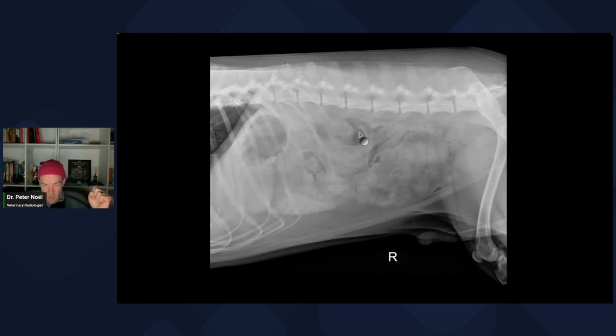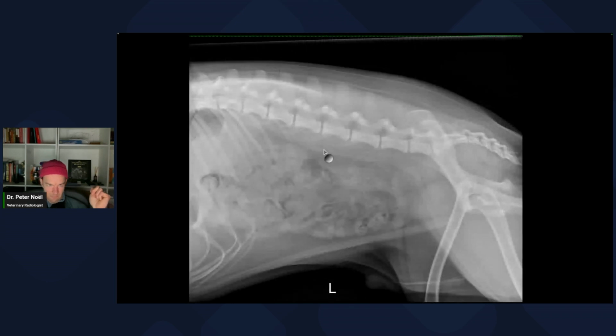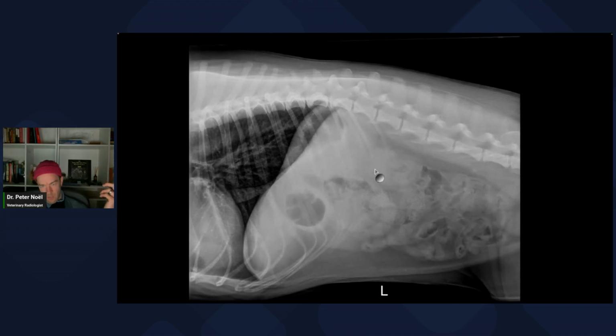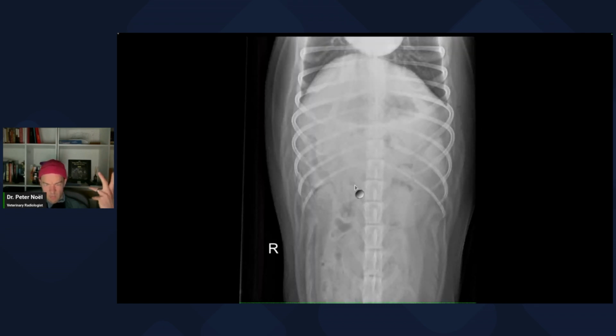They're up here somewhere. They should be up here. Hard to see. There's probably one. Caudal border of the left. Hard to see. Not going to make it. Oh, here we go. This is one right here. And there's the left one right there. I don't see the right one. It's probably there. Feces right here.